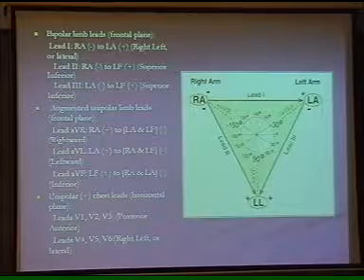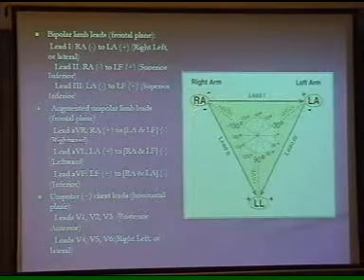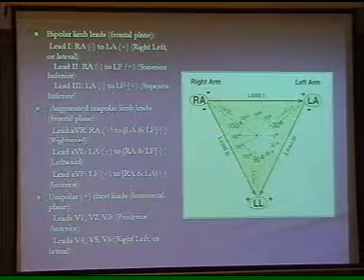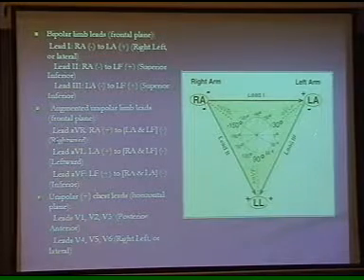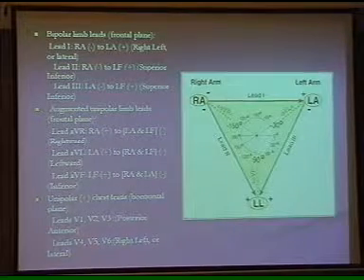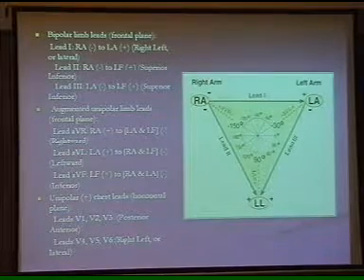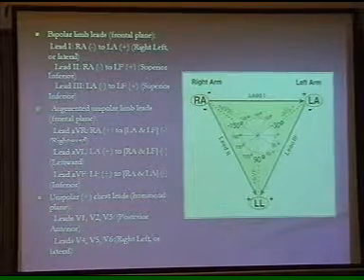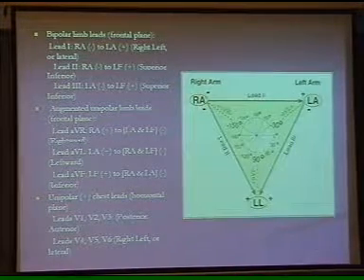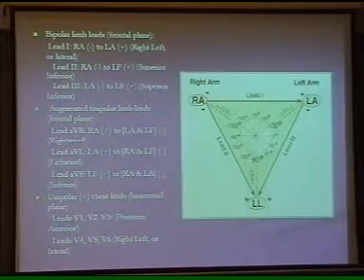Now, I don't think you need to spend time on this one. Between the right arm and the left arm, basically it tells you lead 1. Between the right arm and left leg is lead 2. And left arm and the left leg is lead 3. You don't need to remember all that. You need to just remember that bipolar limb leads are the limb leads. They are bipolar because there's a differential between the two limbs, and therefore they're called bipolar. And unipolar leads are just on the chest, right? So unipolar leads and bipolar limb leads. Next.